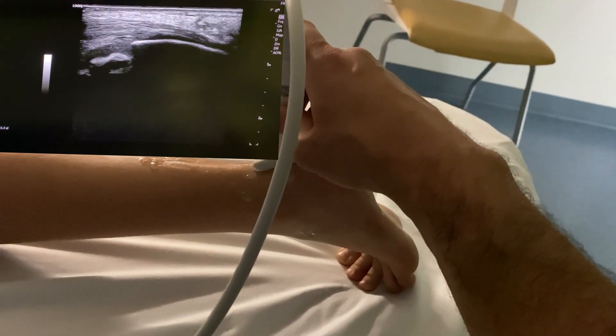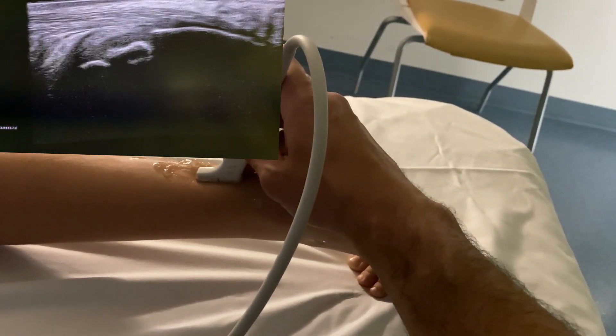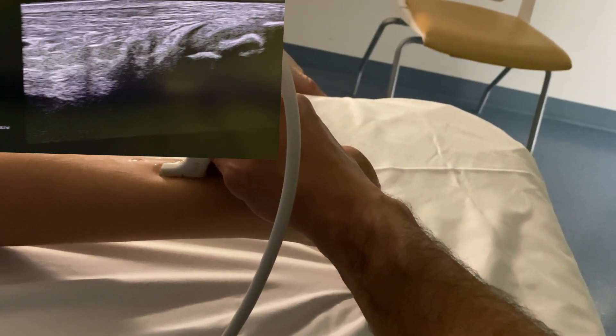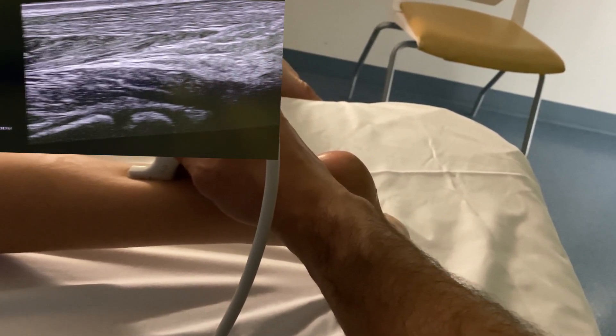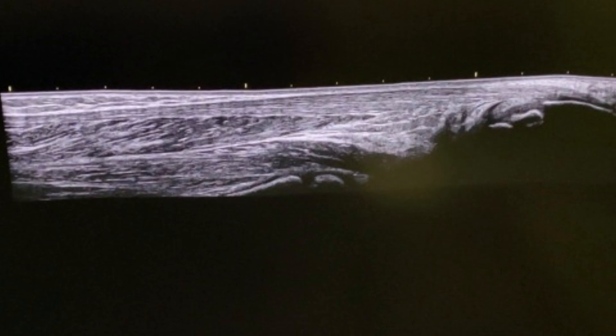Lastly, I like to do a panoramic view beginning at the calcaneus and working my way up into the calf muscles. When doing panoramics, you need a steady hand, a lot of gel, and keep your eye on the screen — it can take a little getting used to. Panoramics or extended field of view are great if there's a large area of tissue affected, a large lesion, tumor, muscular injury, or fluid collection.